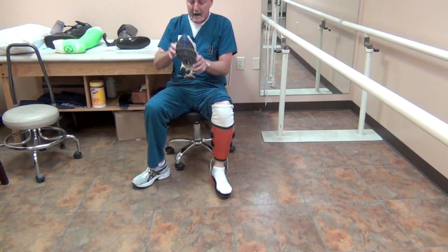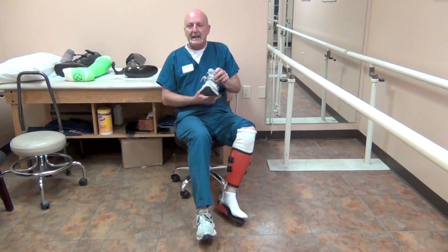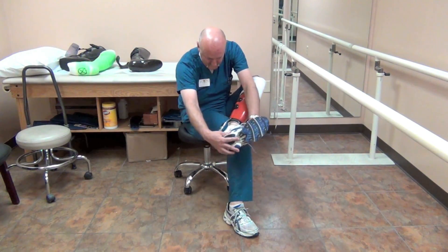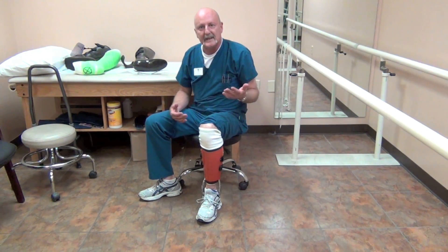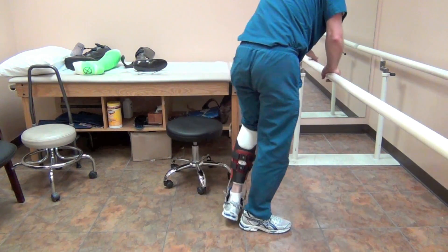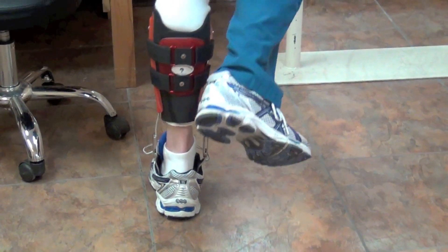This is actually my shoe and it's a little tight — I took the insole out to make room. The patient typically will have to go to a little bit bigger shoe. I'm stepping down and my heel is just right here, and it's not touching the bottom at all.